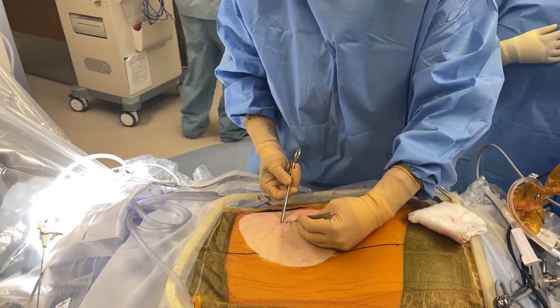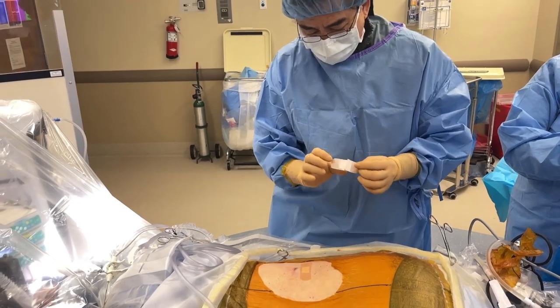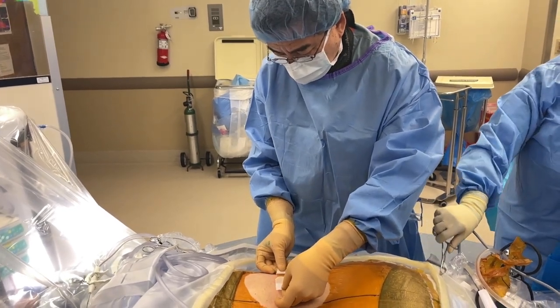One little tiny stitch of a 3-0, some skin glue. And a bandaid is all that's gonna be needed. My surgery's all done. I did it through those little vampire bites. I put one little 3-0 Vicryl stitch in there, and now for the bandaids. My favorite part of the surgery.